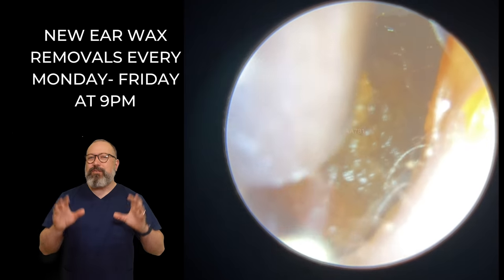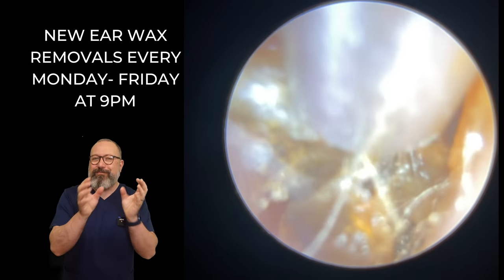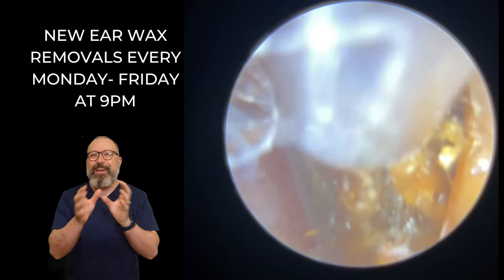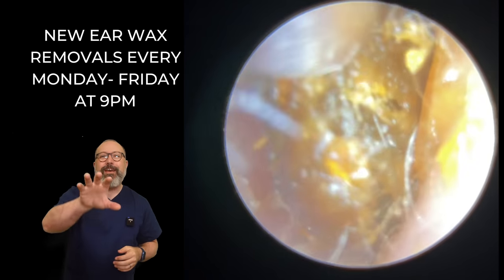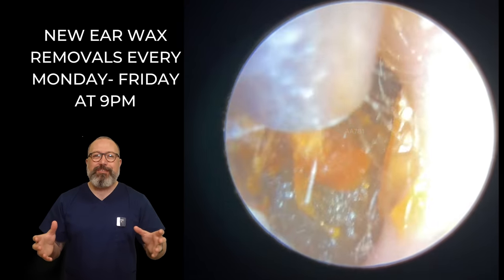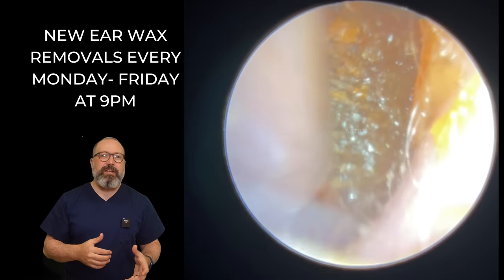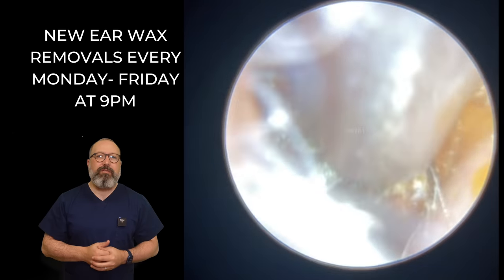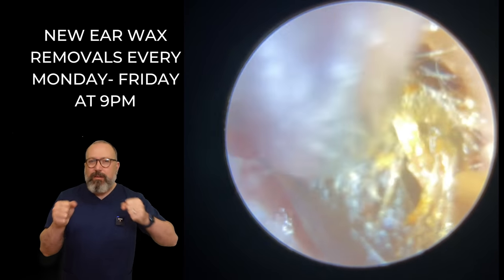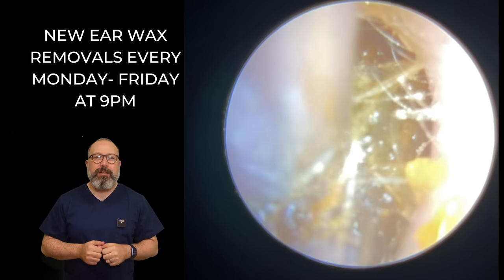We love the wax to be in this kind of Goldilocks zone. You don't want it too hard, you don't want it too soft. It's got a real funny one to try and get bang on right when you put the drops in. But you can see it staying together really nicely. The reason we like this texture is it comes away really easily. You can see it's just really starting to come away from the canal wall. A little bit of wiggly movement needed just to get it off that canal wall and get it out of the entrance to the canal.